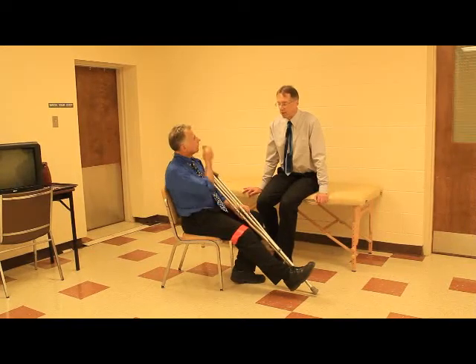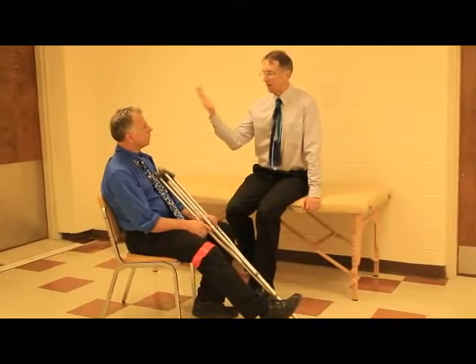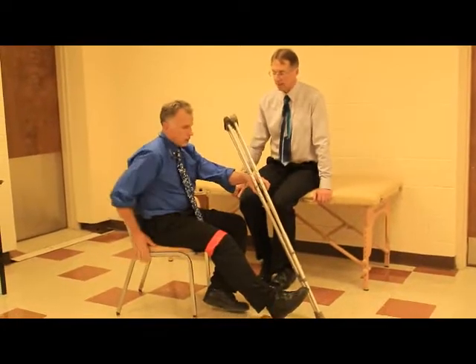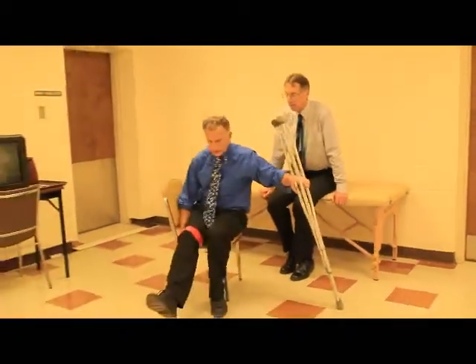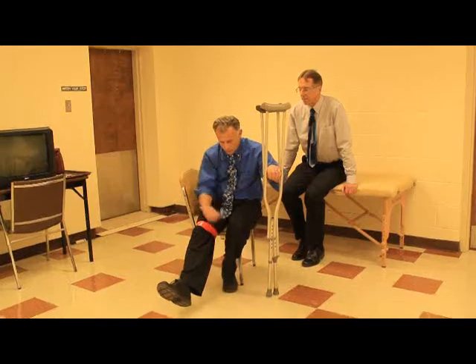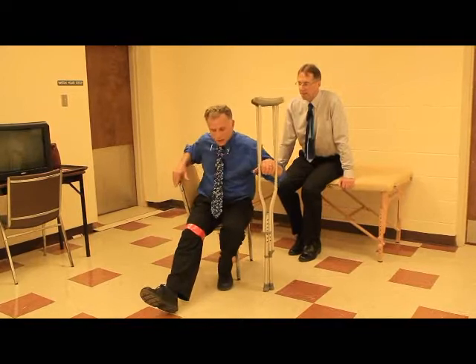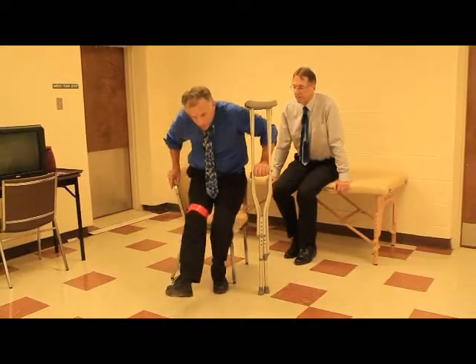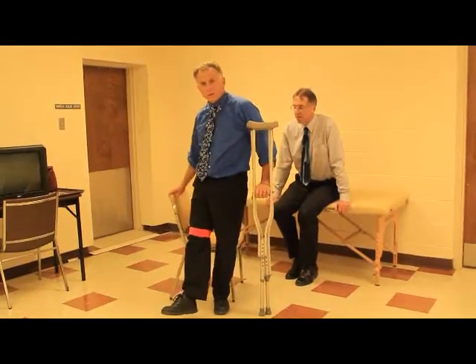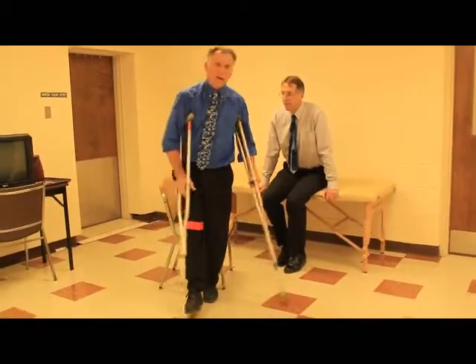We want to avoid chairs with wheels, casters, and also chairs with a flexible back. To get out of the chair, again rotate to the side of the chair, get your crutches together, pull your good foot forward and underneath you, and lean forward quite a bit — nose over the toes as we say. On the edge of the chair, push straight down and up. Make sure the chair is not going to go back — you can get a feel for it if it's a wobbling chair. Then get your crutches in place and carry on with the day.